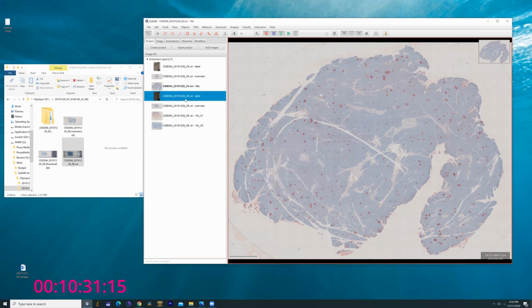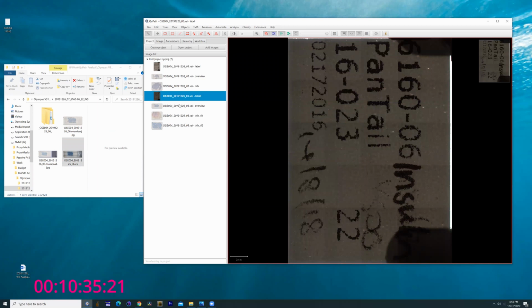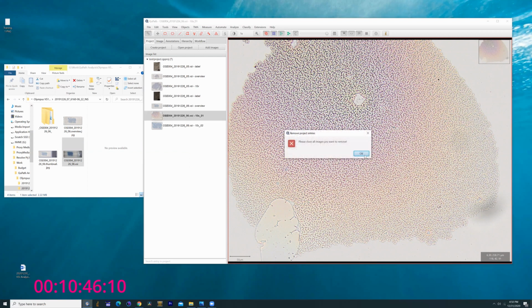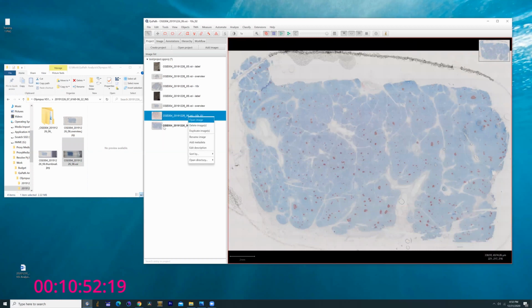In most cases this works and it's fairly straightforward, but in some cases there are additional zones that were identified by the software and not by the user that are stored. I recommend taking this opportunity to clean up and remove those files so you have a nice clean database to play with.